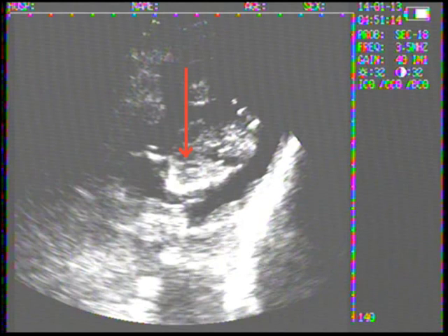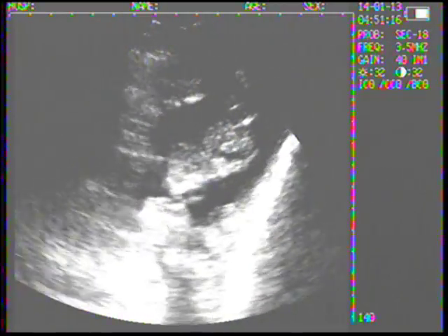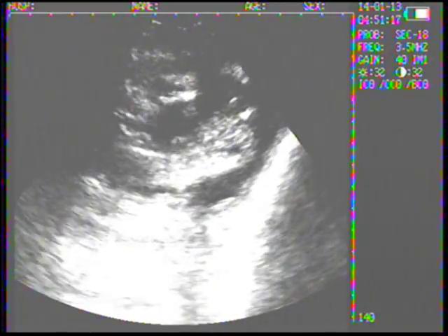In the latter stages, like this, there will be a smaller ring of black around a more complex and oval shape. In fact, in this video the lamb is far enough along that you can see the heart beating. As the probe moves around, the image ends up changing and you can see some of the developments of the lamb before it is lost.